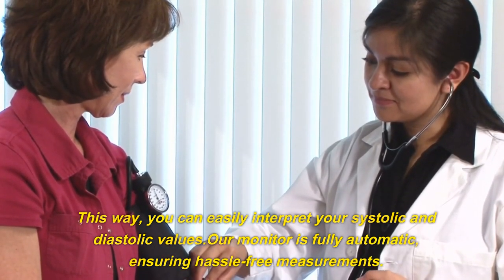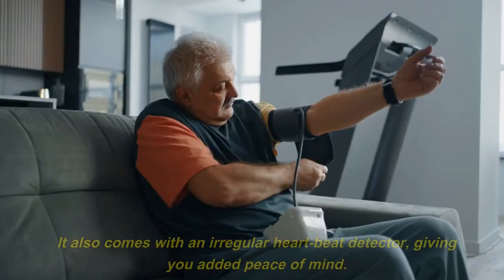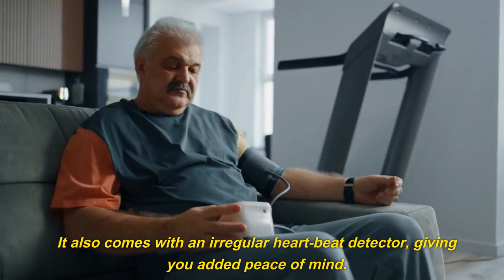Our monitor is fully automatic, ensuring hassle-free measurements. It also comes with an irregular heartbeat detector, giving you added peace of mind.